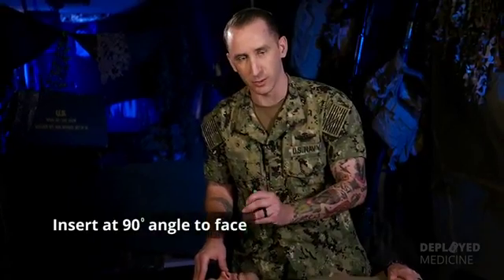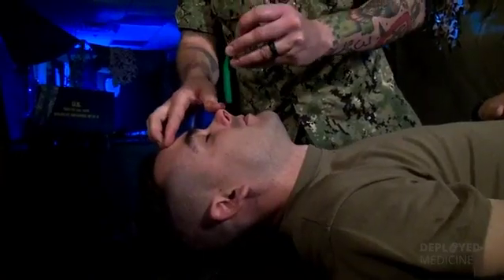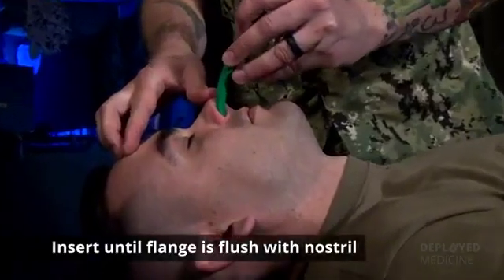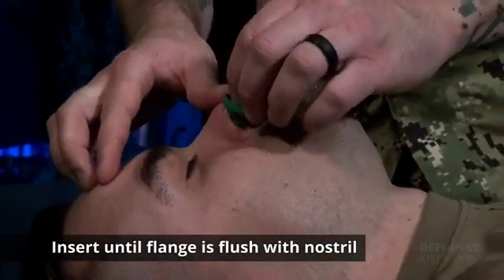When inserting the NPA, ensure that it goes in at a 90-degree angle to the face. Once ready for insertion, it's just a quick, fluid movement straight down.